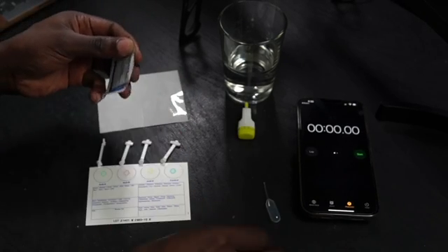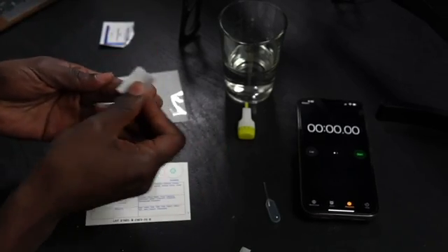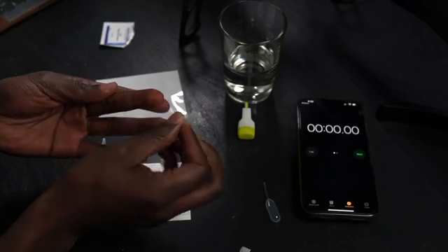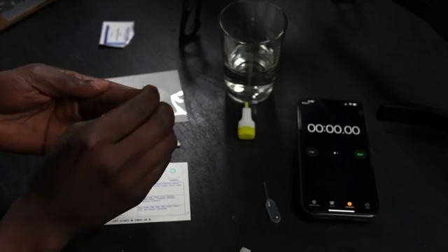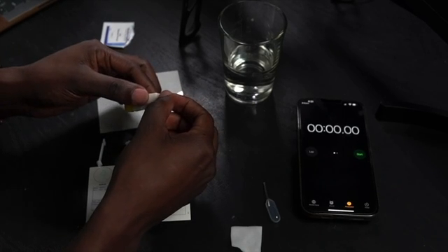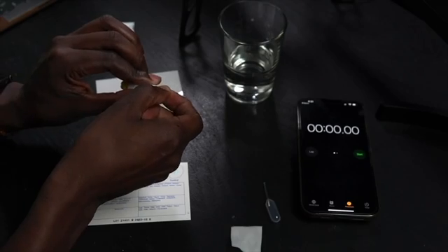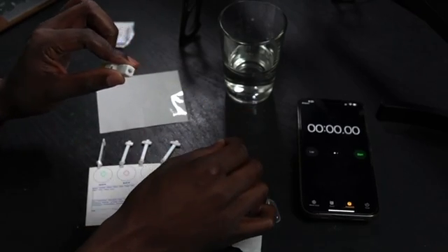Go ahead and take the alcohol swab. I'm gonna do it on my middle finger. I'm gonna swab a few times just to make sure it's nice and sterilized. Then I'm gonna let it dry a little bit. Then the next thing I'm gonna do is I'm gonna take this end here, I'm gonna twist it, and then I'm gonna pull it out. Now you wanna be very careful with this because this is a one-shot thing. If you accidentally activate it, that's it, you can't use it again. So be very careful. I made that mistake once. I had to get a new test. Don't be like me.